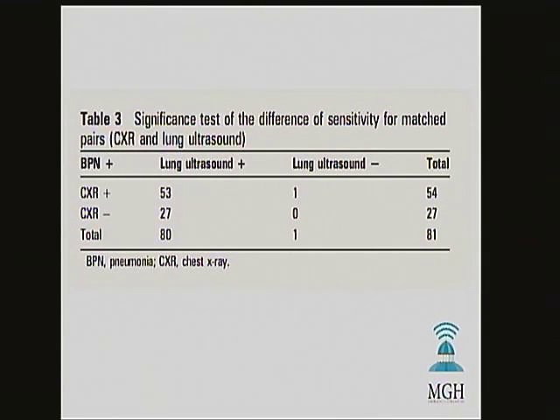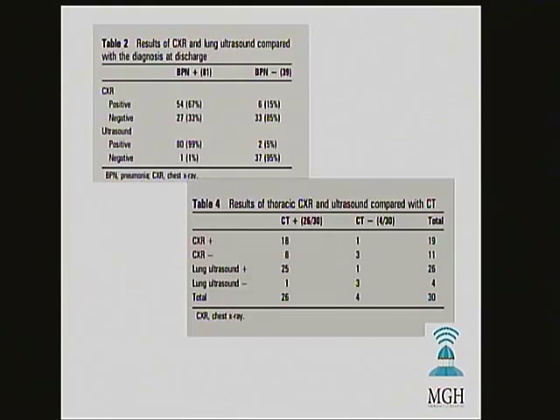Now, these are probably the patients who we send home with antibiotics because they have a fever and a white count and they look sick anyway, and we say, well, your chest x-ray may bloom a few days later. So whether it changes what we're going to actually do with our patients may be up for debate, but I can tell you that when you see this consolidation on ultrasound, it sometimes does push you to giving antibiotics and not waiting for them to go back to their PCP or come back to the ER.